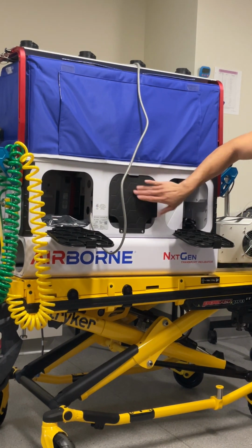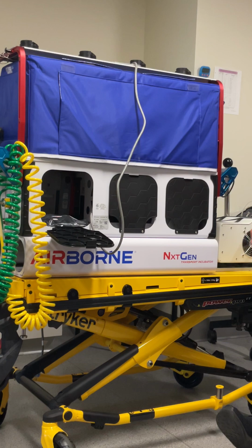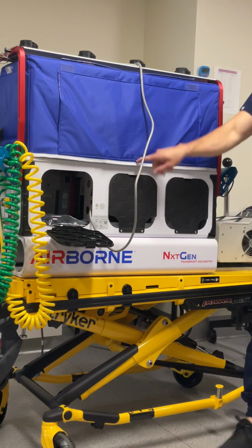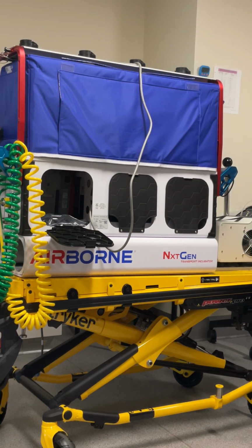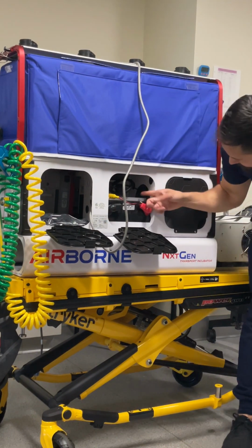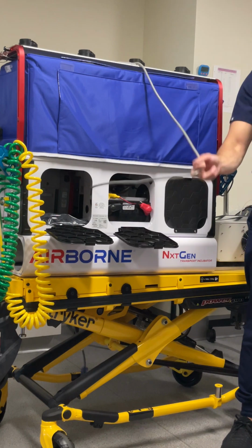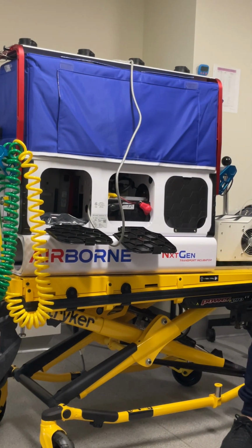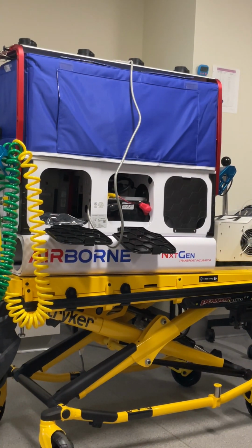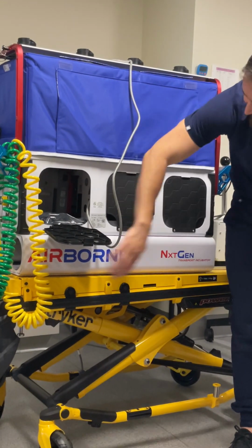Is the main power cord secured internally? It's in this. It's really hard to get out. It's like in here, like in there. But it's secured, like the other ones would work their way loose? No, yeah. It's going through here. I mean, it's technically possible to pull it out, but yesterday we yanked on it pretty hard. You yanked on it. That's correct. It was me. You notice I unplugged it before because I turned it while it was still plugged in. I'm like, wham! I'm like, ooh. So. Ready when you're ready.